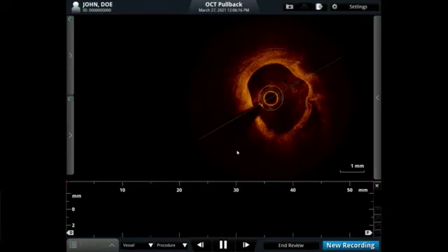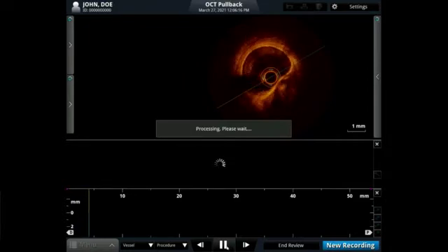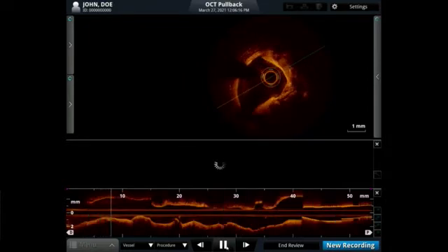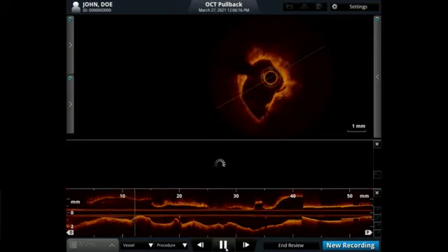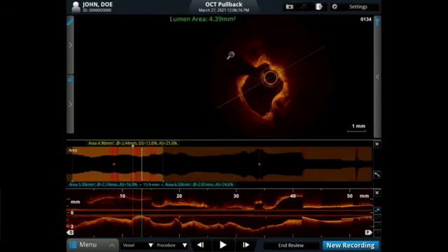At that region of very nodular calcium, there's been substantial, I mean, it's a significant modification. Yes. Look at this one. Yeah, this is the one. This is the lesion, the crack there. This is the exact lesion. The two big nodules here and there, and I'm getting a lumen area of 4.4.